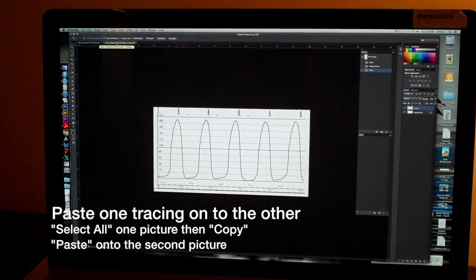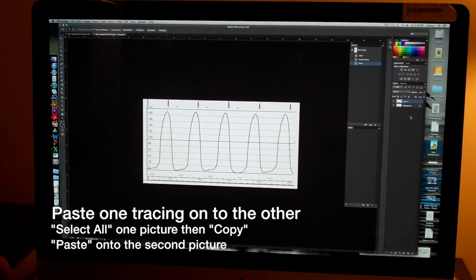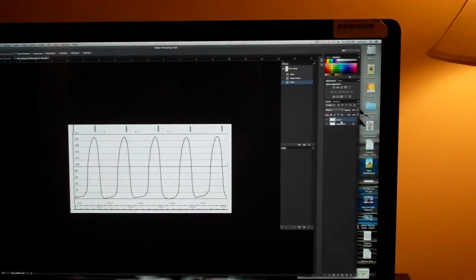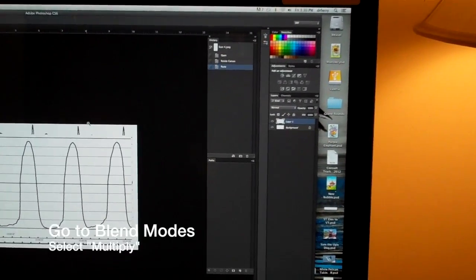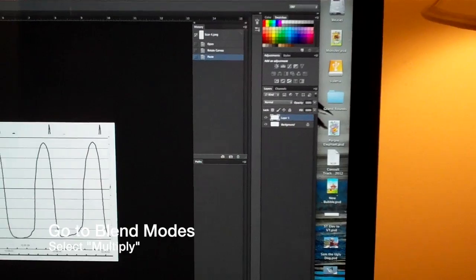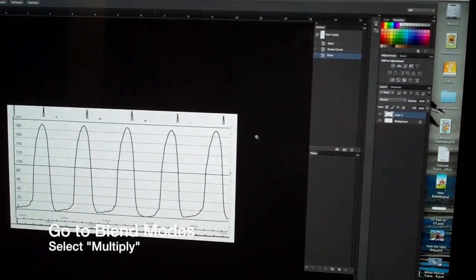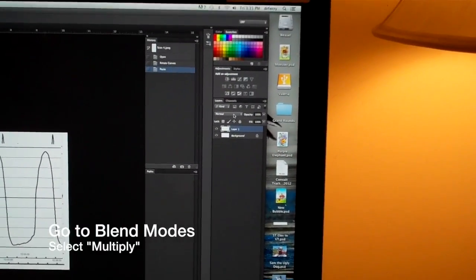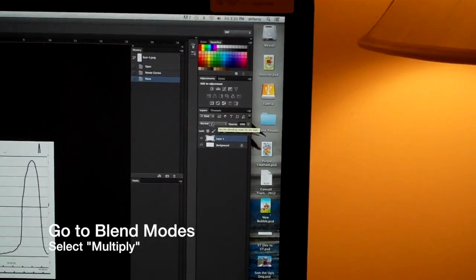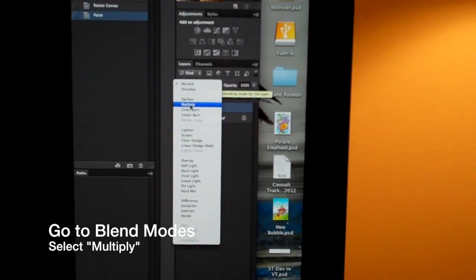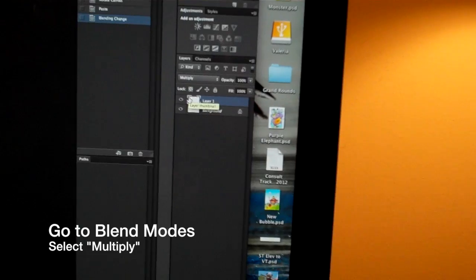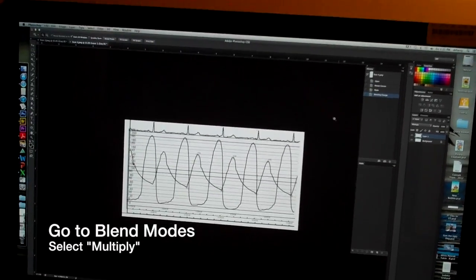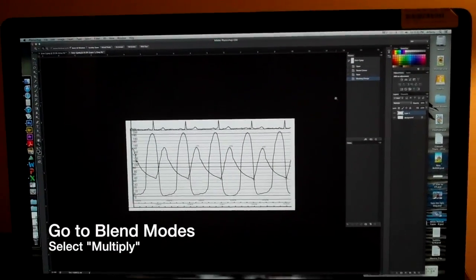So I'm going to go back to the other document and Command V is paste. Now one document is on top of each other in the two layers as you can see. Now how do I get it so that I can see both layers at the same time? The trick here is to go to the blend modes and select multiply for the blend mode. And multiply will allow me to see both layers simultaneously.